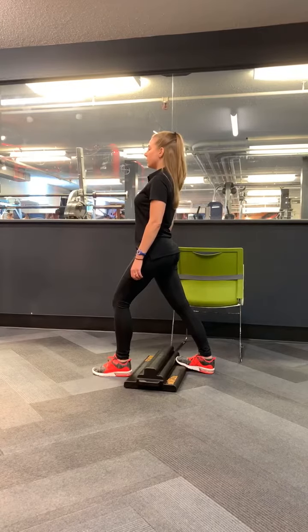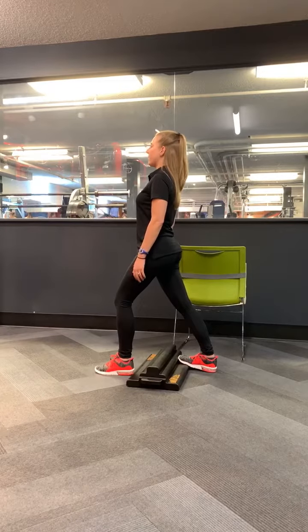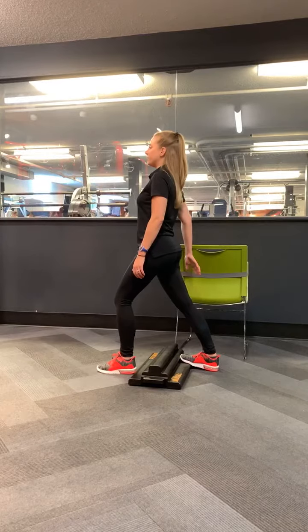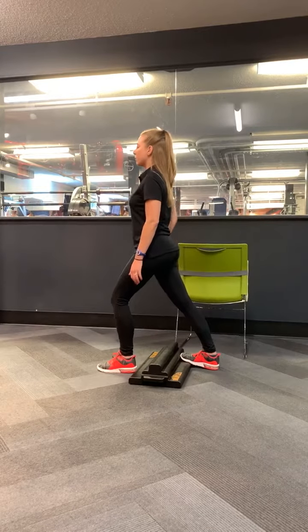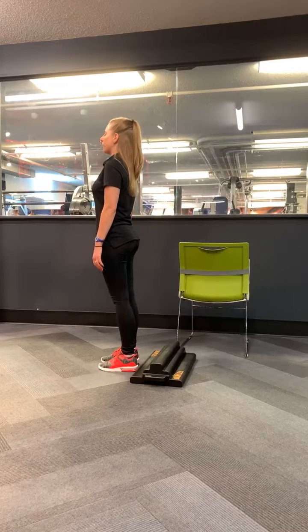And 3, 2, 1. And a very important phase of gait is that 5th phase, the swing phase. That's where the stationary foot comes into play. You're going to bring it all the way over the Moflex next to that other foot.